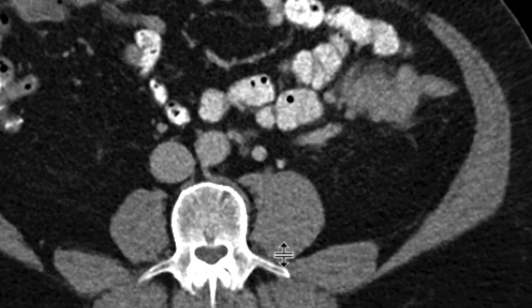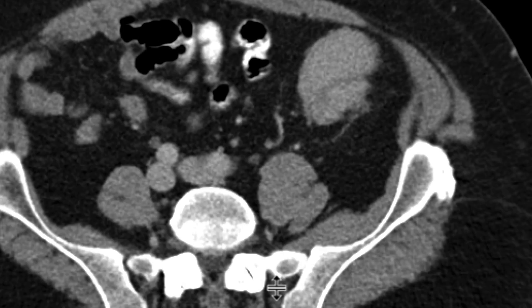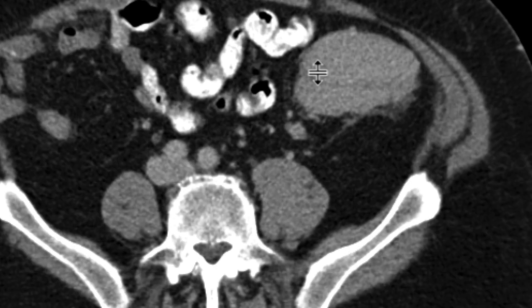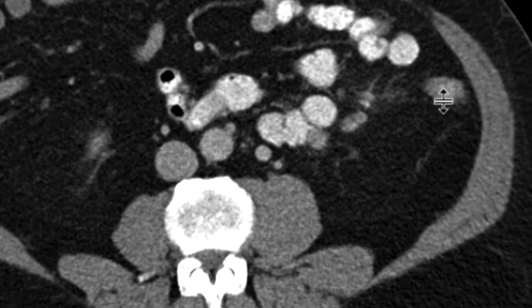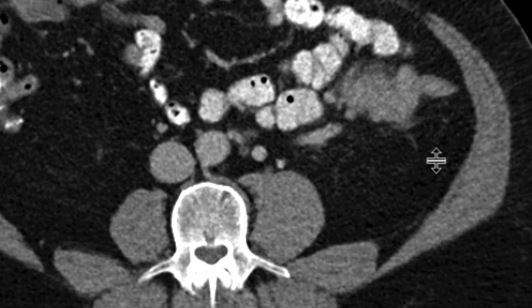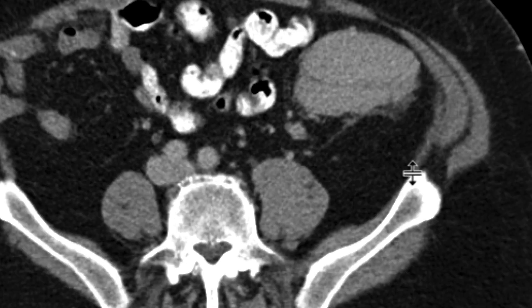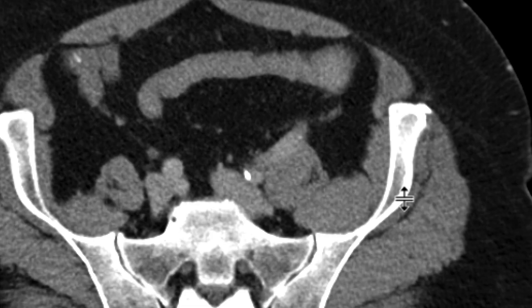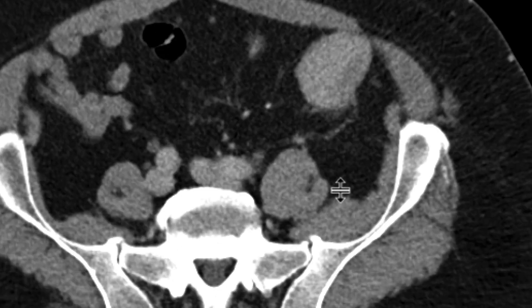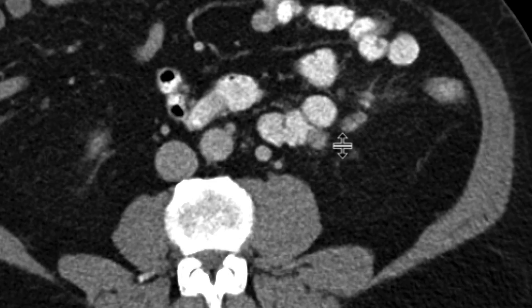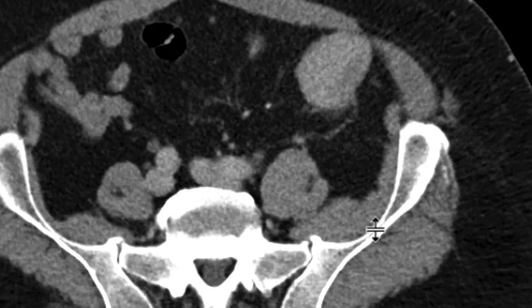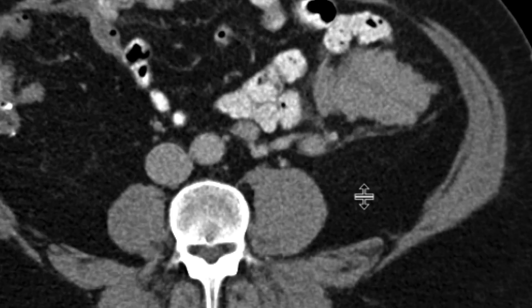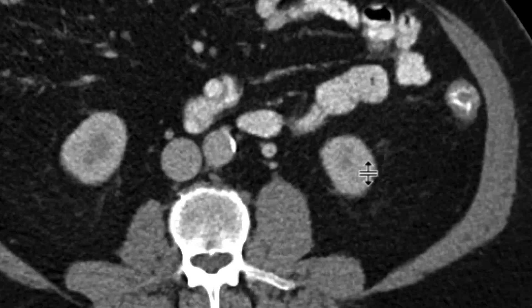As we scroll downwards, we can see that there is an abnormality in the left lower quadrant right around here. As we examine this very closely, we can see that here is the descending colon. It goes right through this region, and out it comes — here is the sigmoid colon. So a portion of the large bowel is just crossing through this area. This abnormality itself is a soft tissue mass, and we can see that there's a little bit of adenopathy adjacent to it as well.